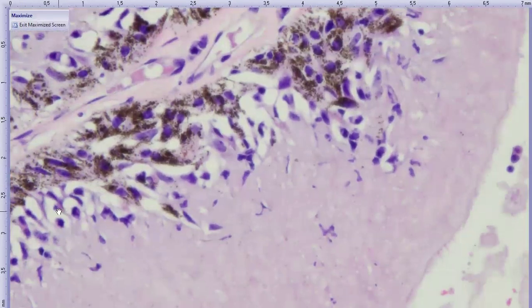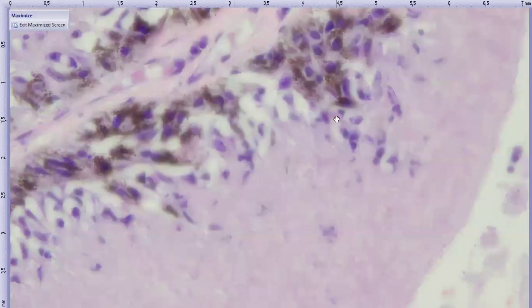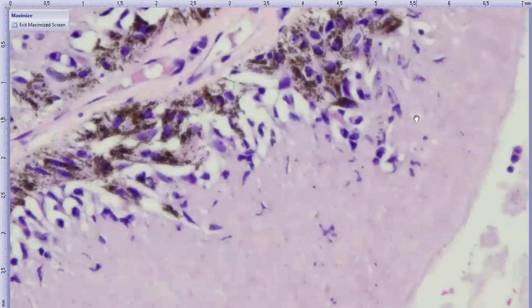And in the non-pigmented layer, you can occasionally see these little linear, brightly eosinophilic bodies. So these are in Colorado referred to as Cooley bodies. You probably won't see them published as such. You may just see them called linear eosinophilic inclusions.